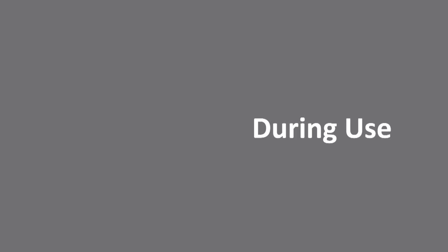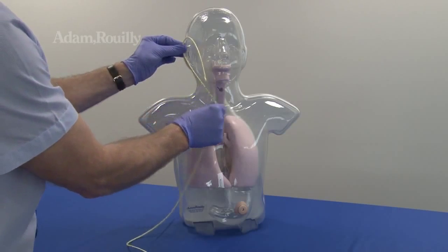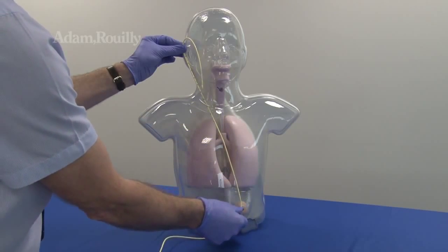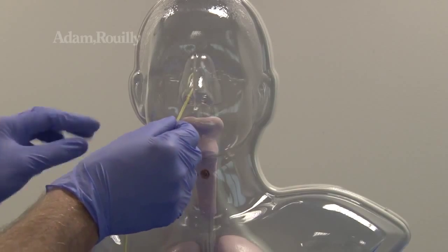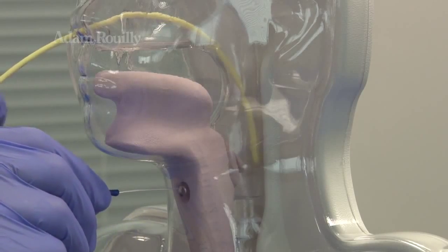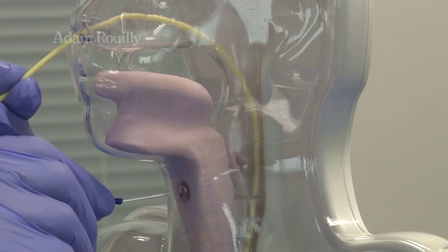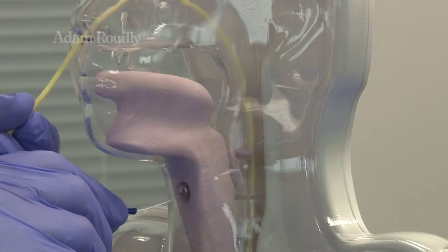During use, the nasogastric tube can be measured before insertion as on a real patient. The movable epiglottis simulates swallowing, whilst the transparent anatomy aids visualization of correct nasogastric tube positioning.